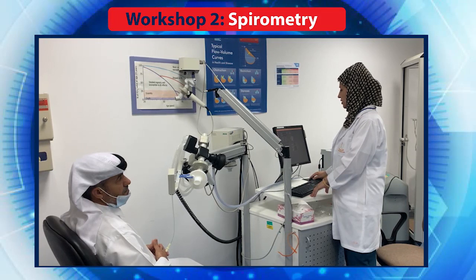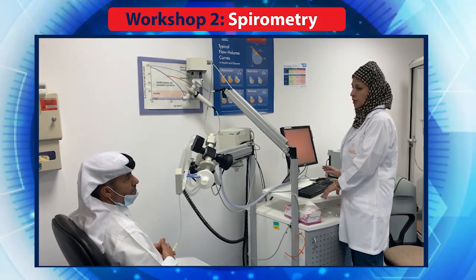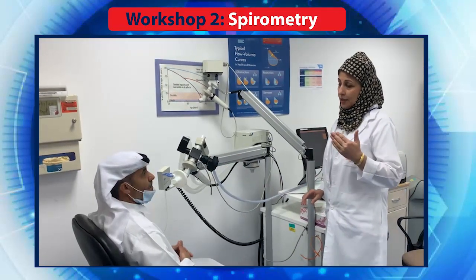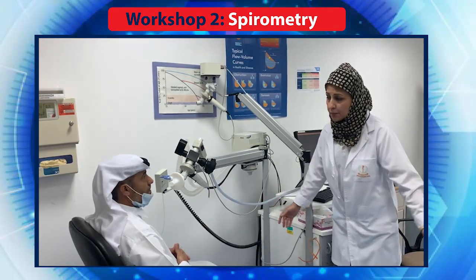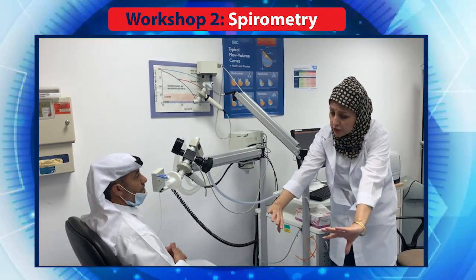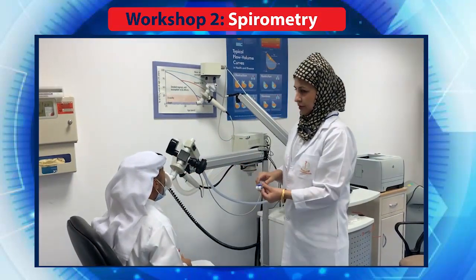So once everything is done, now we're gonna start. Okay. So before starting, I wanna explain to you how you do it. So you take a deep, normal breath, 3 times normal breath, and then big breath till your lungs are completely full, and blow out hard and fast. Blow, blow, blow. When everything is finished, then big breath again. Okay? So yeah, very good.